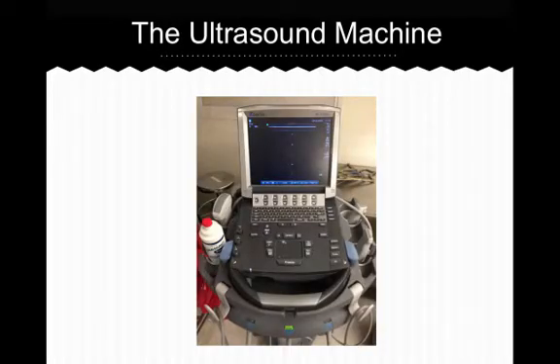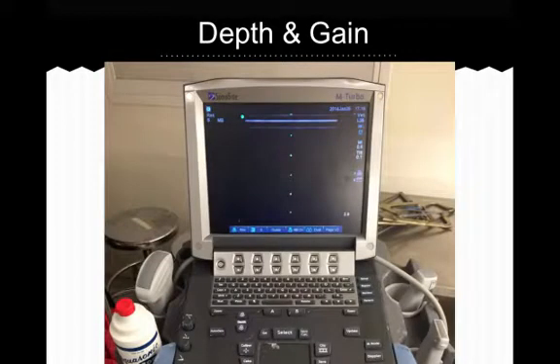This is an image of the ultrasound machine we'll be using today. At the upper left, you'll see the on button. On the right, you see an arrow pointing to the high-frequency probe, which we'll use today to try to identify fractures. To select this probe, trace the path of its cord to where it plugs into the machine and turn on the button until the green light illuminates. Next, place gel on both the probe and the patient. An image will appear on the screen.